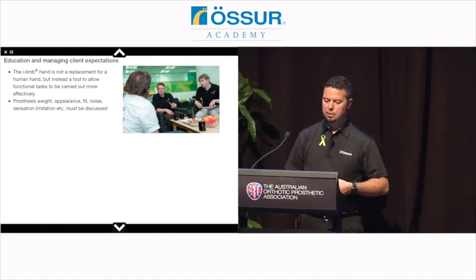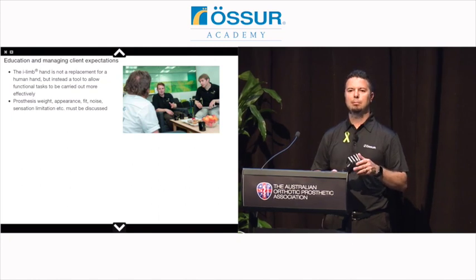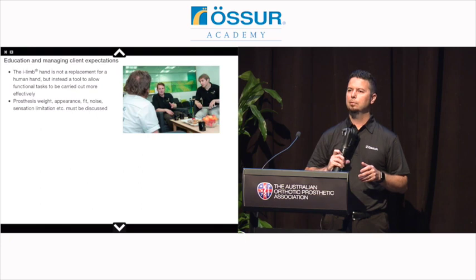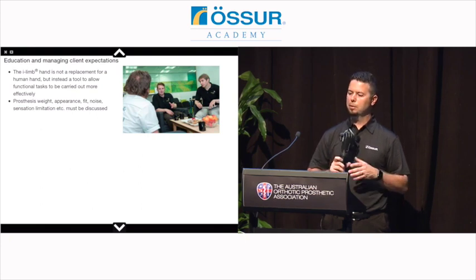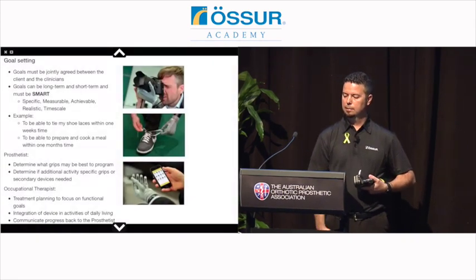Also, you have to consider that the prosthesis does add weight, appearance, fit, the noise. The noise doesn't typically bother people, but sometimes when you hear that motor running, maybe you're picking up a hymnal in church or somewhere quiet, maybe that would bother the person. You need to make sure that they understand that.